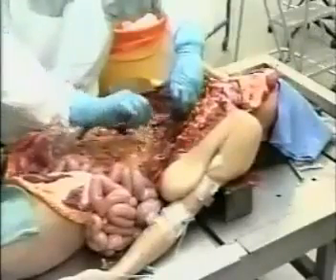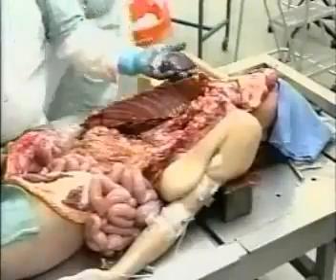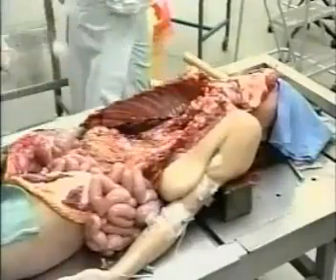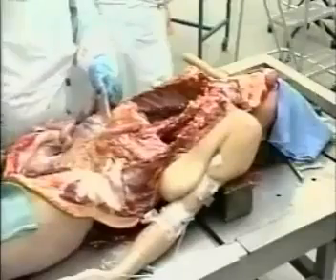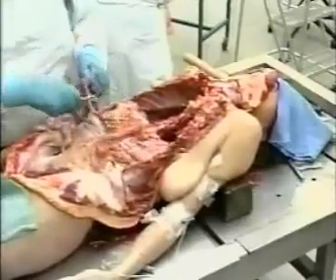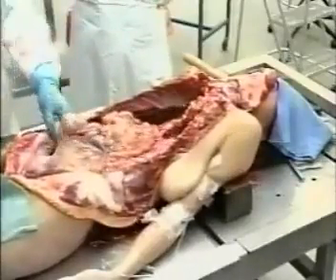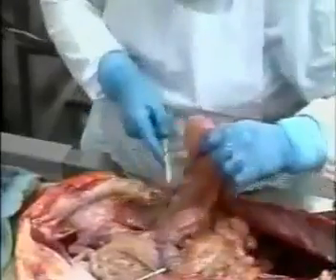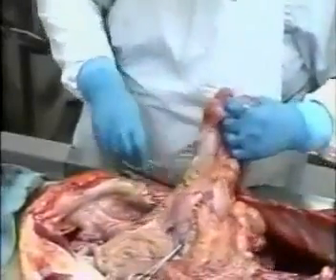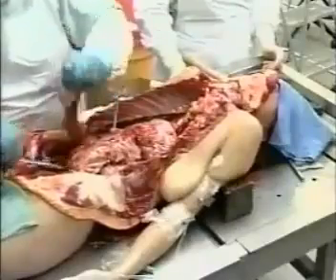Pardon me, spleen is coming out now. That sits in the left upper quadrant of the abdomen. That's about a normal shape and size. What he's doing now is putting a clamp on the proximal end of the small intestine, the duodenum, and then he'll free up all of the intestine so that it can be removed in a block. And there we go.